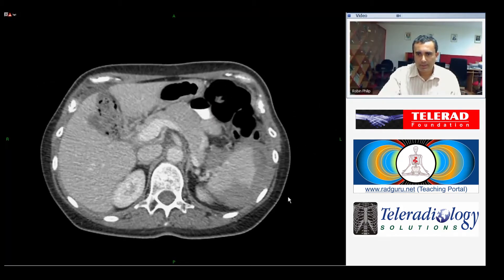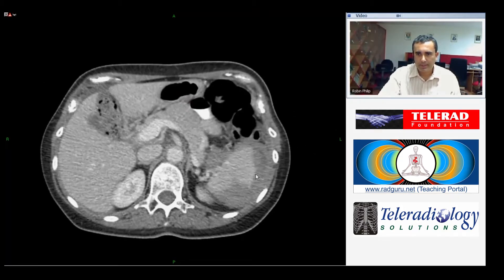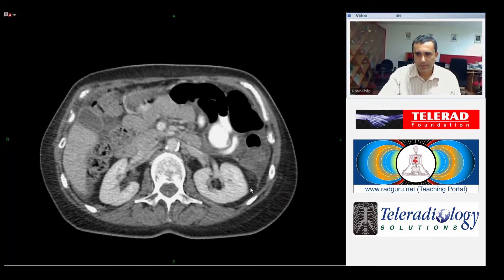Coming further down, we start to see the spleen, which has an irregular contour. There appears to be a collection beneath the capsule, and there is a large defect in the parenchyma.